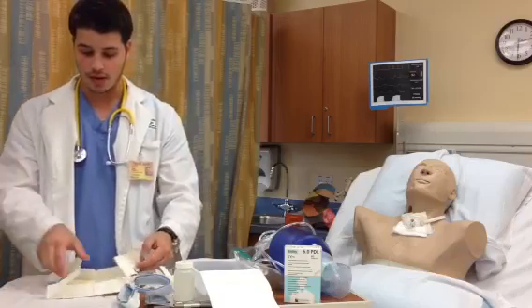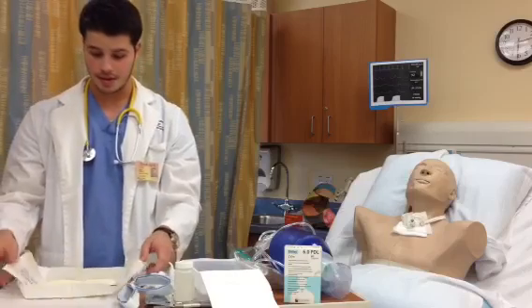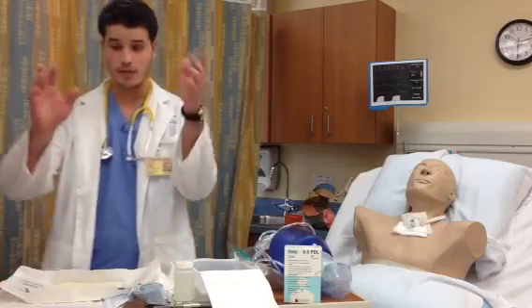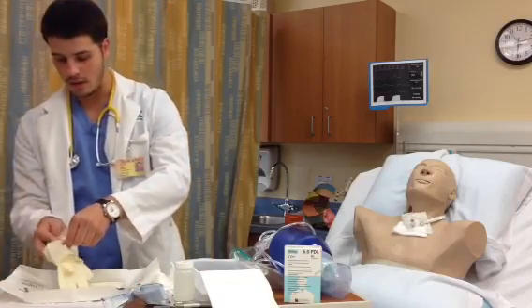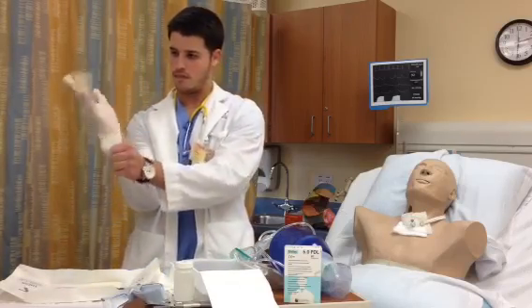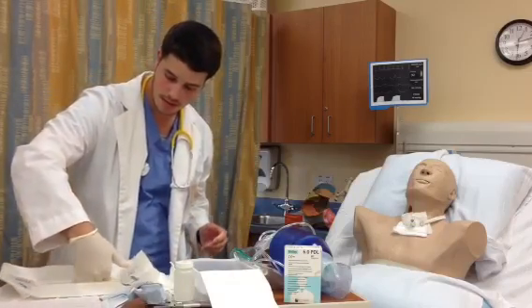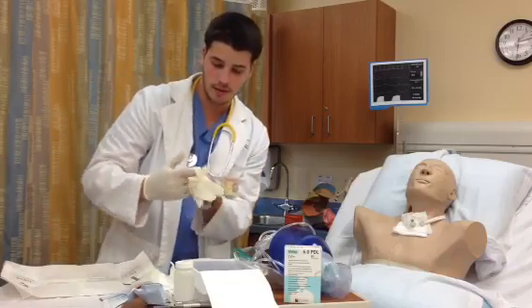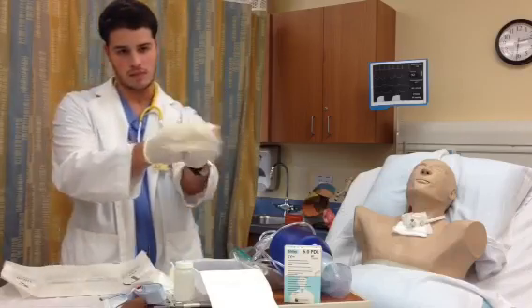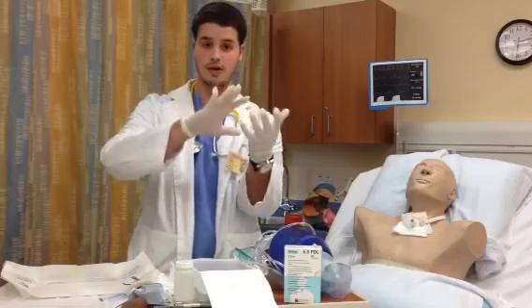I will show you how to put sterile gloves on. Your hands are dirty. You don't want to touch the outsides of the gloves. So you're going to reach in and aim your thumb, and then the rest of your fingers. Then you're going to go in like this, and you're going to do your other hand, aiming your thumb first. You could touch the outside of the glove with your other glove because they're sterile.